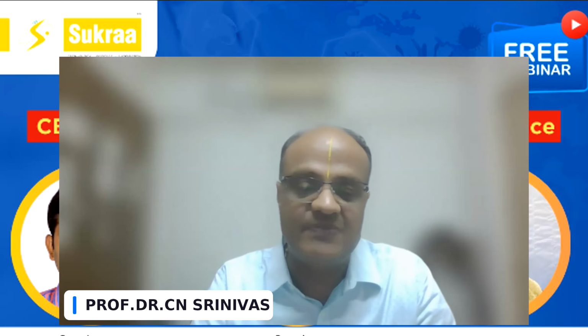How will you analyze the lipemic sample, as it interferes with the hemoglobin value? Will you be asking for a fasting sample for the CBC work in such a case, or will you use any lipemic plasma replacement methods? So I will answer this. Whenever we have a lipemic sample, the first value to be affected is usually the MCHC. MCHC being a sensitive marker to lipemia, it increases, it will be more than 37, and that will be an indicator that it's a lipemic sample.